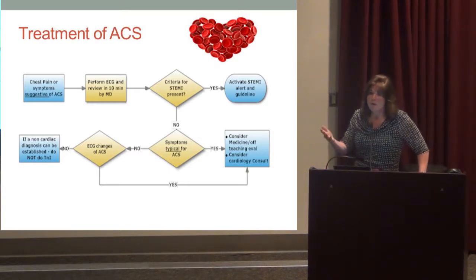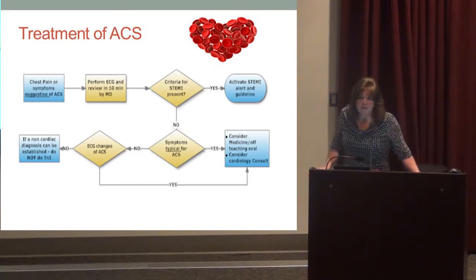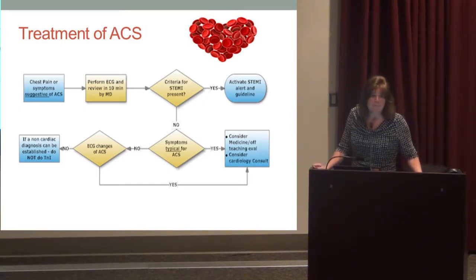If you're especially working in the units that you all do, you need to look at your EKG. If the doctor reads it as a STEMI, 7822. Even if you're incorrect, even if you've overcalled it, we'd rather have it called. Okay, and we'll figure it out.